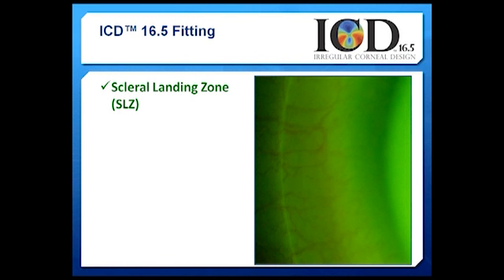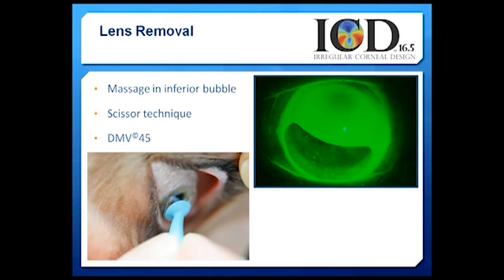And then lastly, we're looking for good alignment of that edge with the conjunctival tissue. Do we see the fluorescein, do we see the vessels running past the edge of the lens, taking their normal path? Is there any blanching whatsoever?